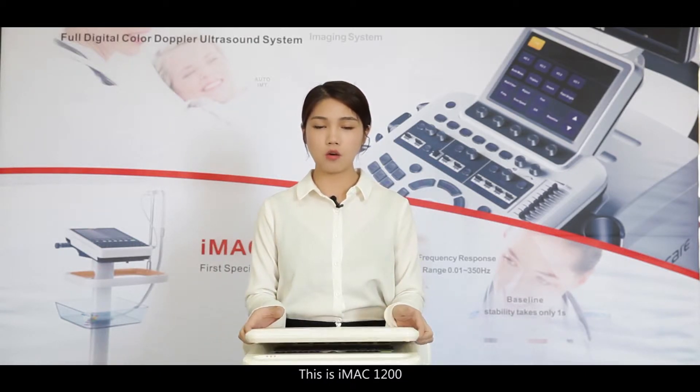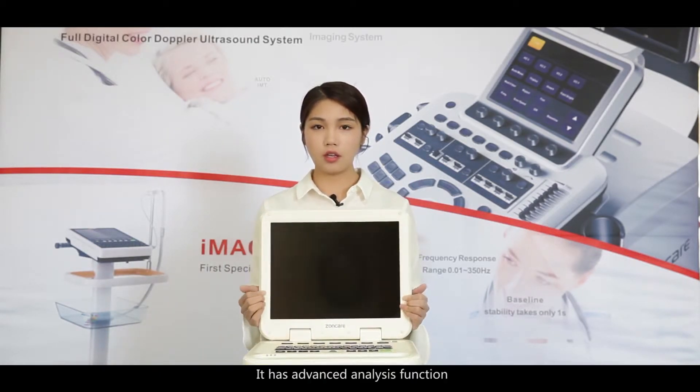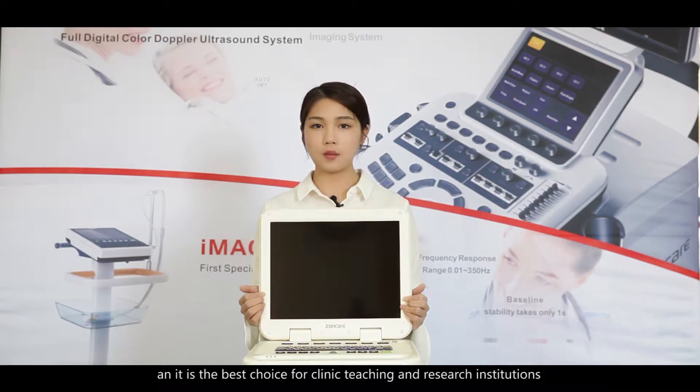This is the iMac 1200. It has an advanced analysis function and is the best choice for clinic, teaching, and research institutions.